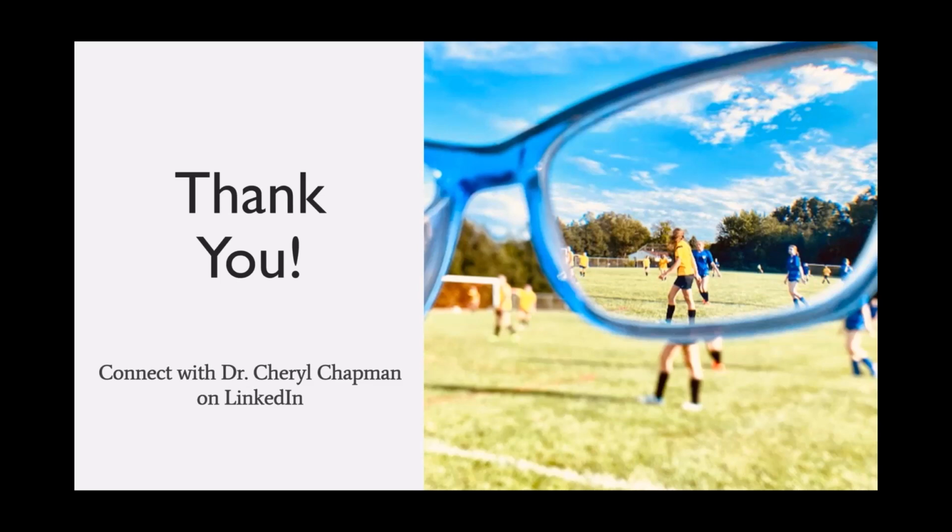Now, if you're really concerned that central SPK is so bad that it could cause an abrasion, you might need to reevaluate that. But I don't think I've ever actually discontinued wear because of central SPK that was causing a central island. The one slide that I had that did show that central abrasion was actually an Ortho-K patient who had developed keratoconus. We did discontinue their orthokeratology wear, and they ended up doing cross-linking, and they're doing quite well.